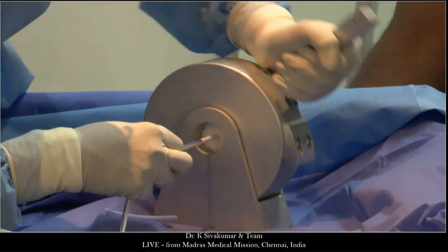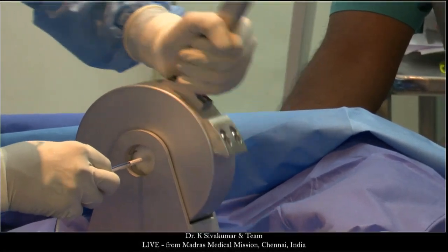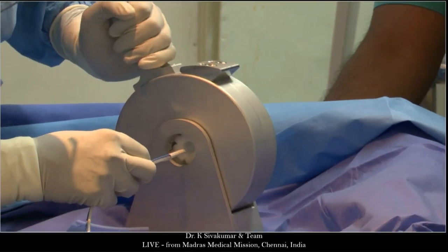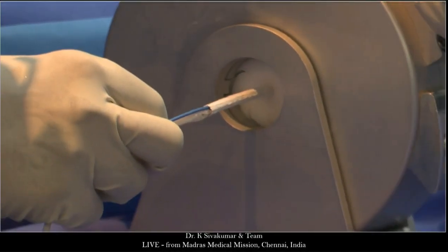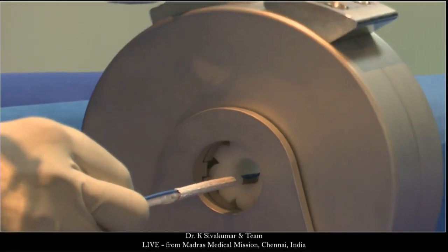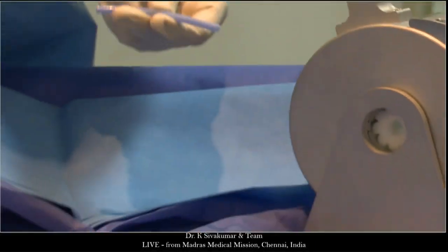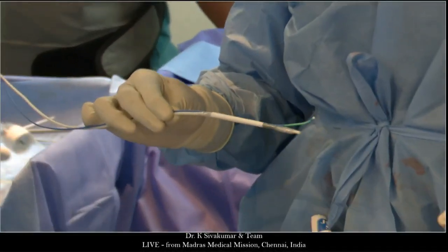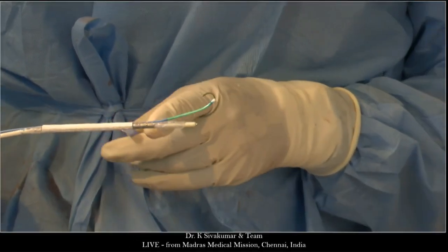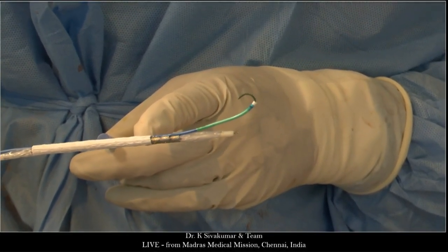You have the catheter passing from the strut, correct? Yes, from the junction between the covered and uncovered. So I will take it out once again and show you in a much more magnified way. Just give me a second. Very interesting, actually. I will come closer to the camera so that you can see it far better. Now I will show you. This is the covered portion, the uncovered portion, the junction I have come out. Can you see that?